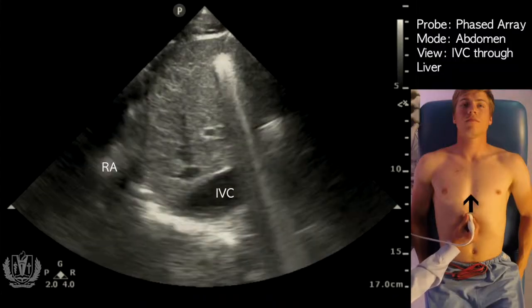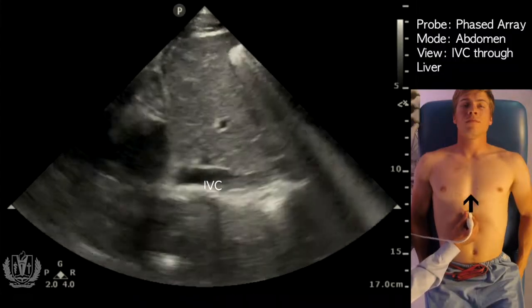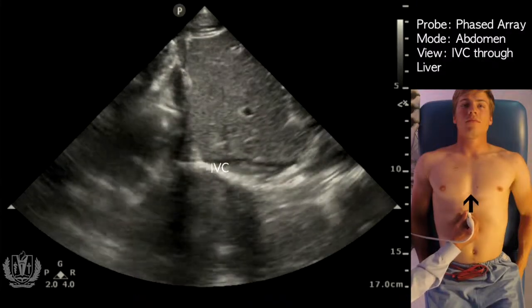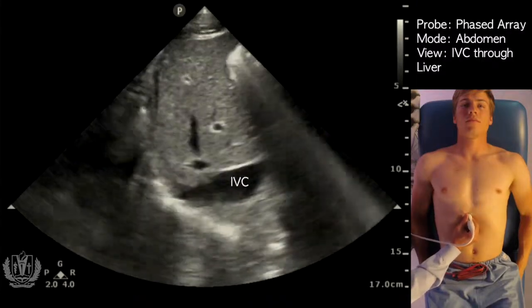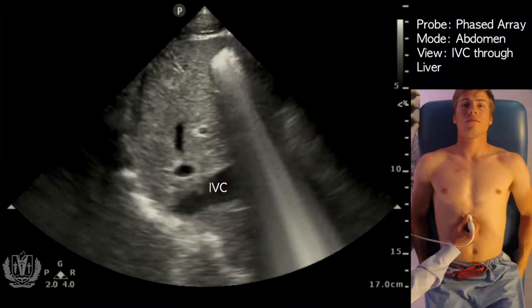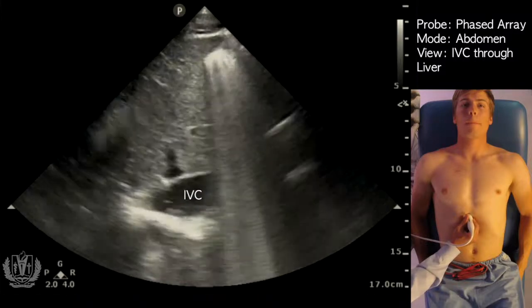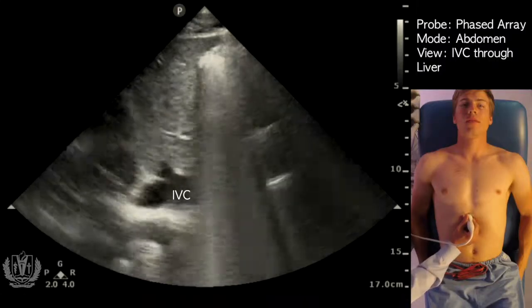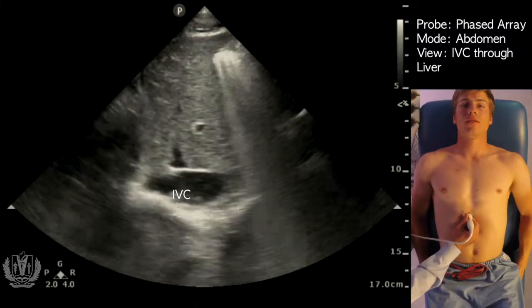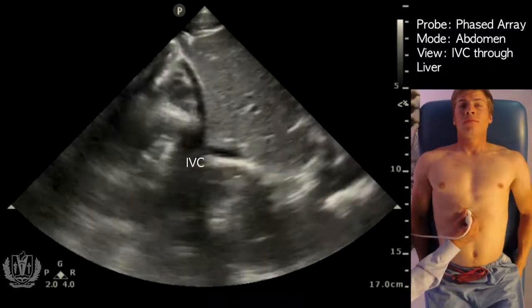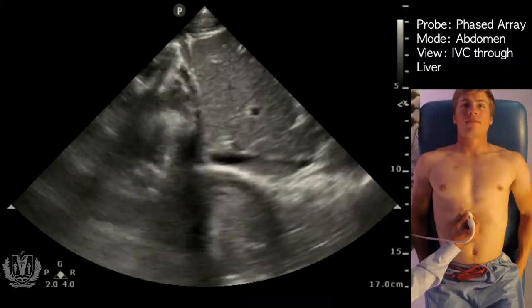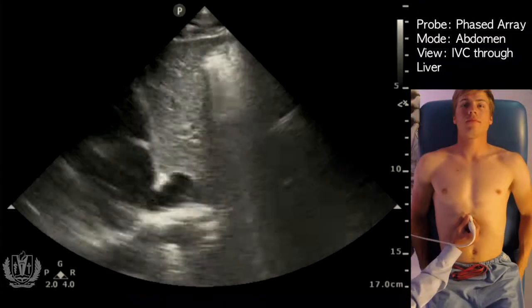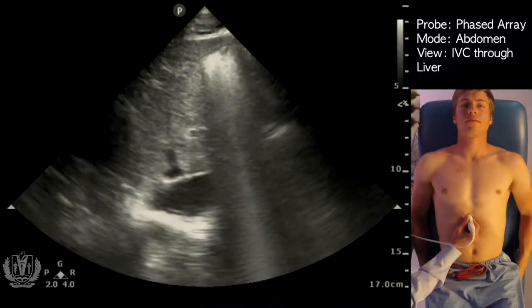You can actually see the inferior vena cava entering the right atrium right there. As our patient takes a big breath in, you see that the IVC collapses — that's a sign that his right atrial pressures, or central venous pressures, are low, and he should be able to tolerate fluids. The general consensus is that more than 50% collapse indicates a low right atrial pressure in this view.